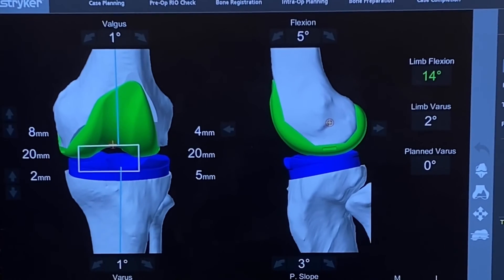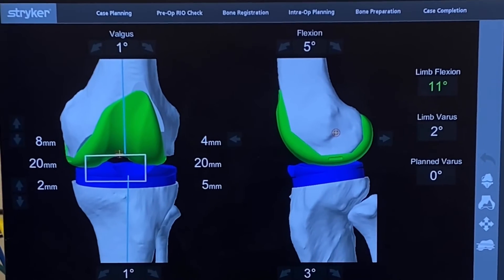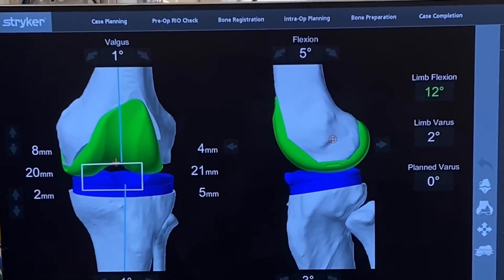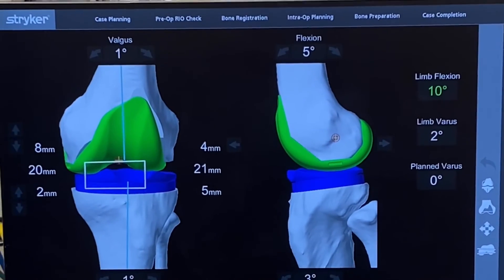Numbers are great. It says 10 but that leg looks straight to me. It says 10 but that leg looks straight — I think it was hyper to start.